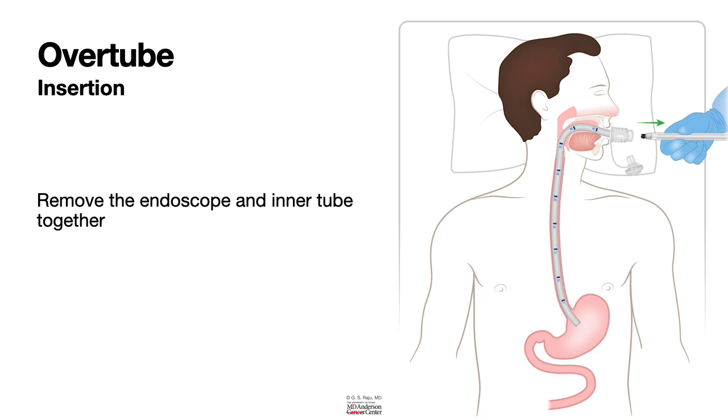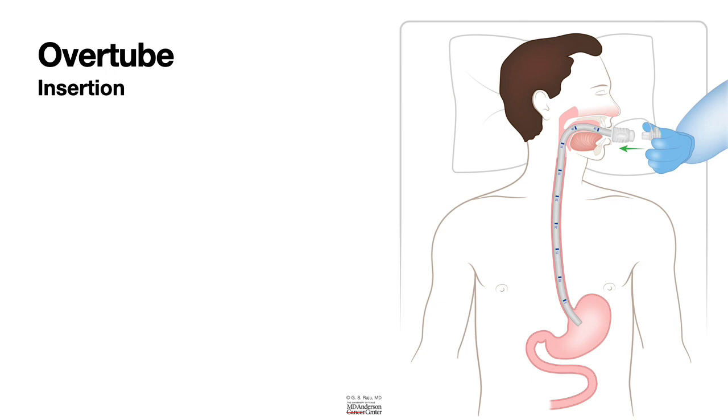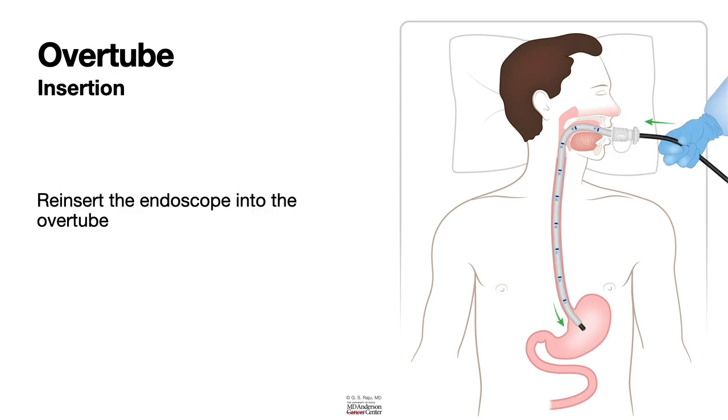Basically, you take it out. So the inner tube is used to allow you to go in, and once it's in, you take the inner tube and the endoscope out, and then you place the insufflation cap over the outer tube, and that maintains the air insufflation. Then you reinsert the endoscope into the stomach through that outer tube that's already in place. So now you can do whatever you want to do.